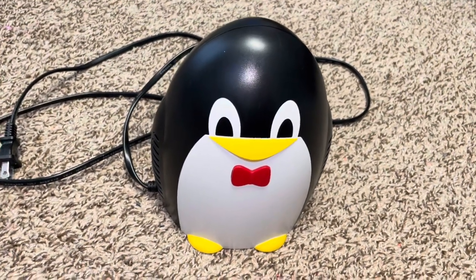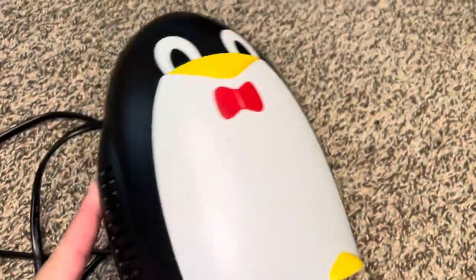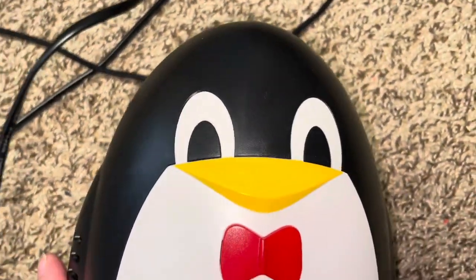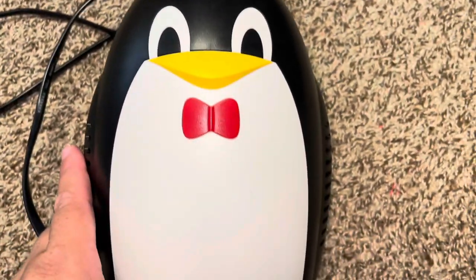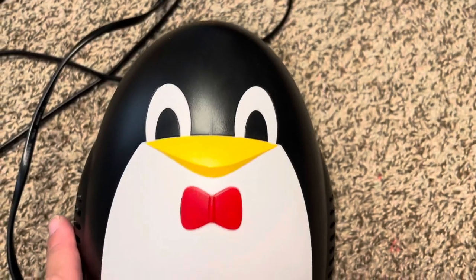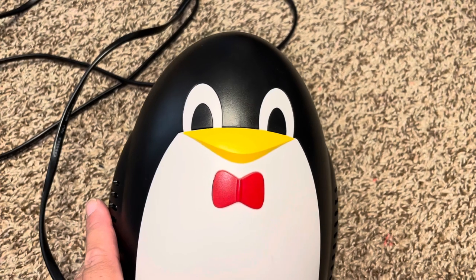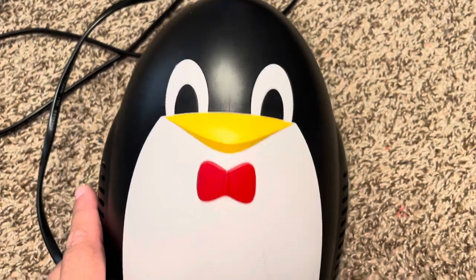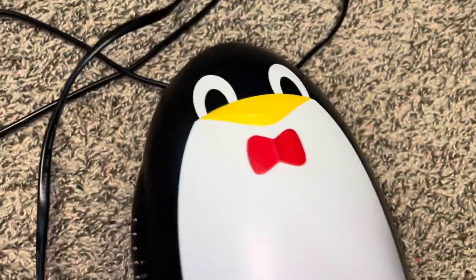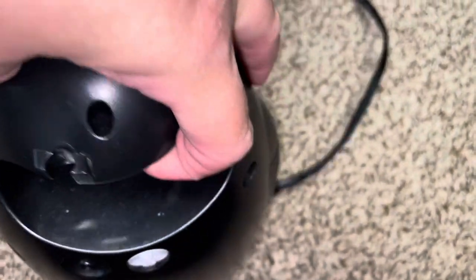I'm going to show you what it looks like and let you hear it. It's super cute — when you have a very small kid, regular nebulizers can be a little scary because they're loud. But this is so cute my three-year-old was not scared of it at all. He didn't want to do the treatment at first but after a couple tries he was totally fine. It has a little red bow, little feet, and here is the back.